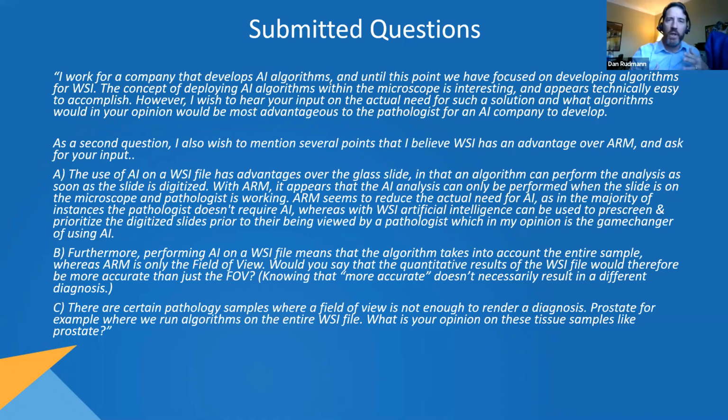So it's the synergism. And when you do the whole slide imaging in advance, and then you provide it to the pathologist, then the synergism is not quite as much there as when you're looking at the pattern, doing the pattern analysis real time, and then incorporating the AI as you're looking through the microscope.